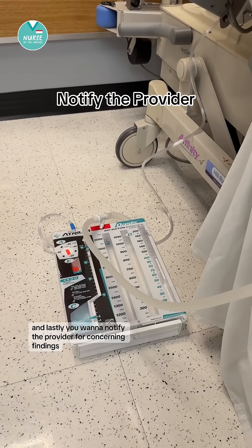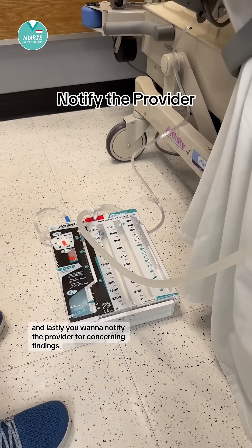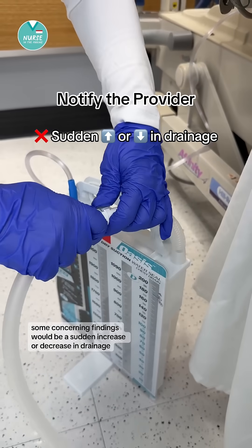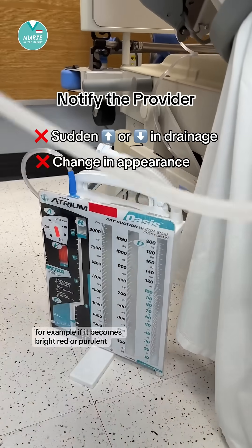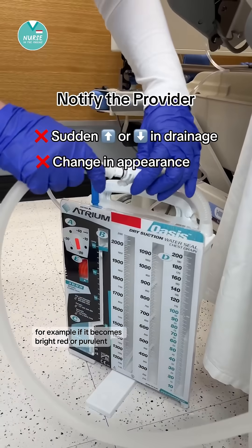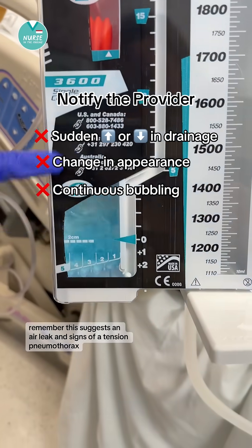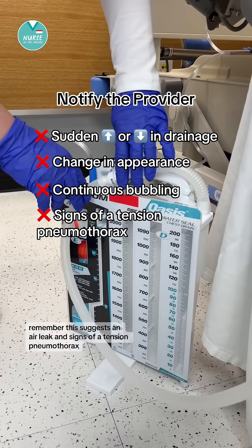And lastly, you want to notify the provider for concerning findings. Some concerning findings would be a sudden increase or decrease in drainage, a change in drainage appearance — for example, if it becomes bright red or purulent — continuous bubbling. Remember, this suggests an air leak and signs of a tension pneumothorax.